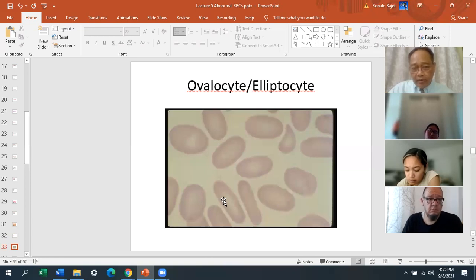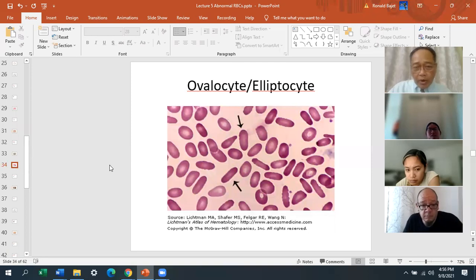Okay, forget I said iron deficiency. I apologize, I didn't mean to say that. It's B12 folate or the megaloblastic anemia. So oval macrocytes are seen in the megaloblastic anemias, and those are the pernicious anemia and vitamin B12 and folic acid deficiency. So oval macrocytes or ovalocytes and elliptocytes. Some more elliptocytes, ovalocytes. Okay, it's a little bit better here. Nice central pallor in all of them, looks like. But still, I don't see too many. So this is probably hereditary of something, because I don't really see too many normal red blood cells here.